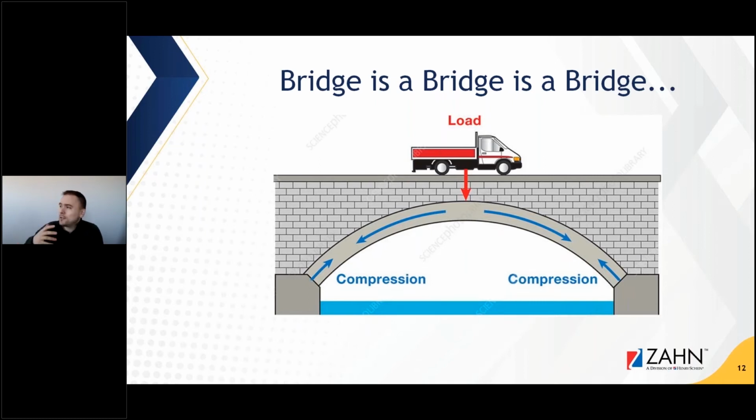So to put that in perspective, a bridge is a bridge is a bridge. That's what we like to say, right? Because it doesn't matter if it's a bridge in the mouth or a bridge out there, Brooklyn Bridge or Manhattan Bridge. The same physics apply to it. So if you look at the typical arch bridge design, you're going to see how the bottom is rounded. And so when the force gets exerted onto it, the force keeps bouncing back and forth, and it's able to freely travel throughout the bridge. If you did not have that arch underneath, you just had a straight square, that bridge would not last very long and you would have a lot of problems. And the engineer would probably lose his job. So that's basically the same concept you should try to implement when you do your bridge designs.